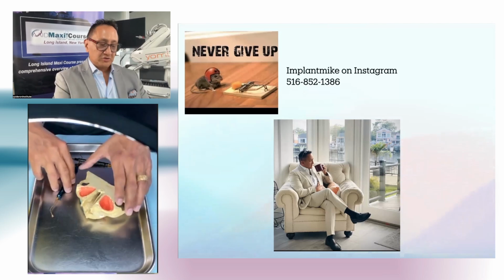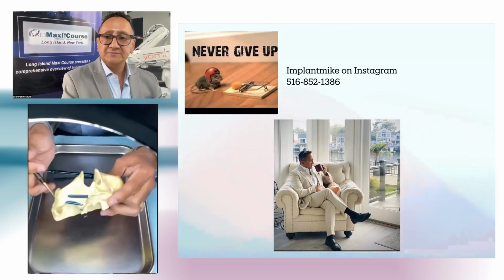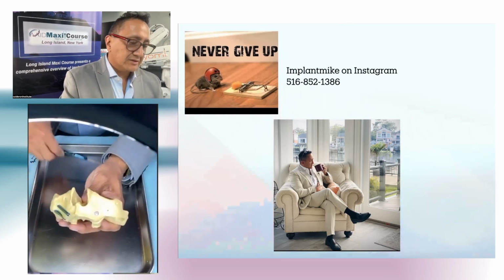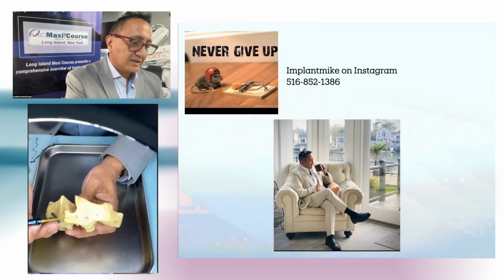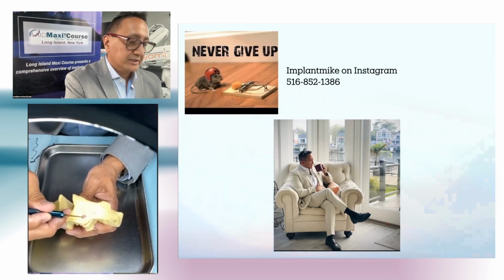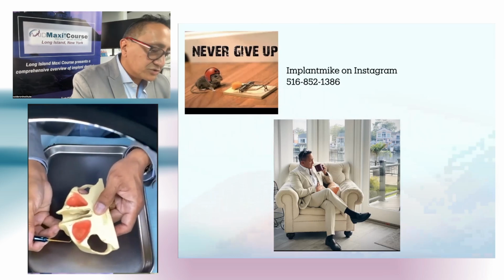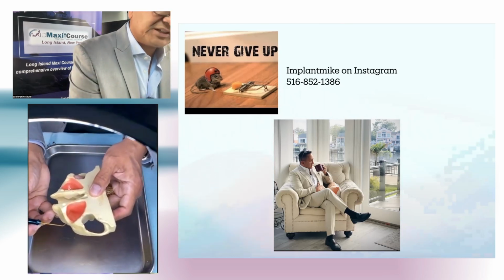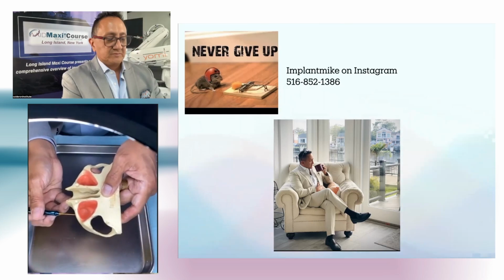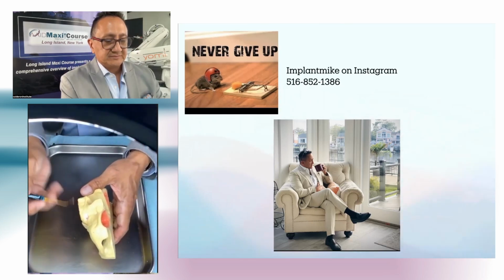Let's come over here to show you with the models again. So now what happens here with the models, if you can appreciate this, on this sinus lift kit, it comes with a little dome here that I'll go in here and I'll start to relieve the soft tissue this way. And as we showed you before, I'm going to stand up for this. It pushes out the tissue this way. Okay, so this would be a lateral wall sinus lift.